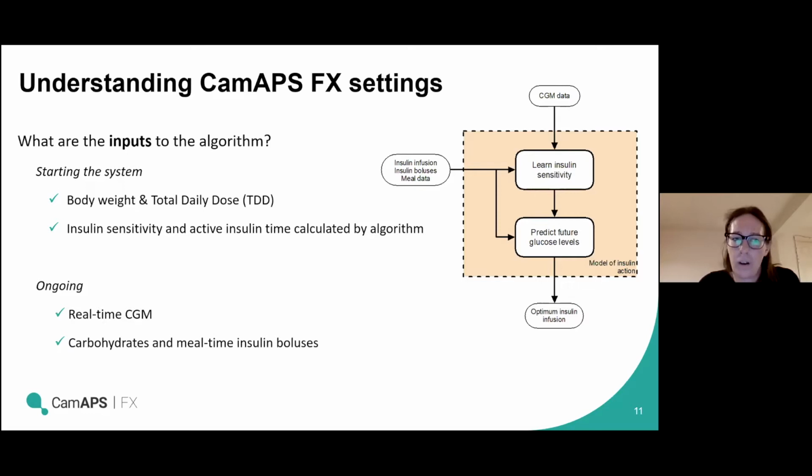In terms of ongoing inputs, it obviously requires real-time continuous glucose monitoring data from the glucose sensor, and the carbohydrate and mealtime insulin boluses need to be entered manually.